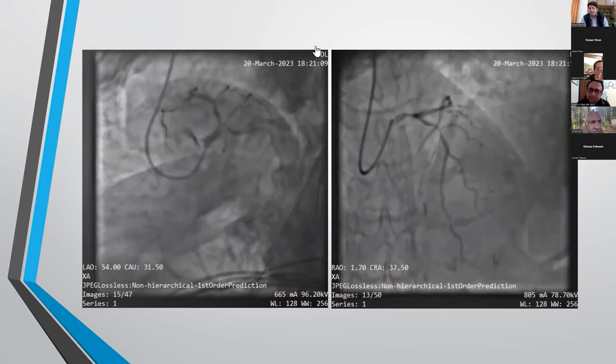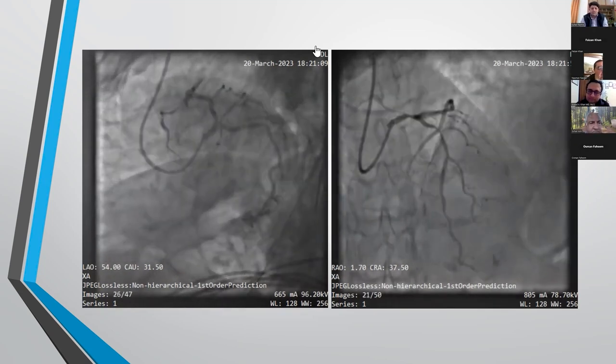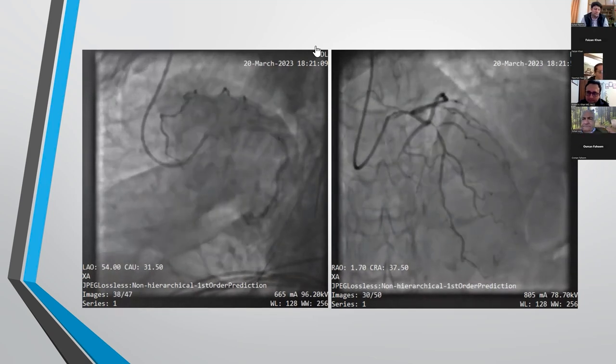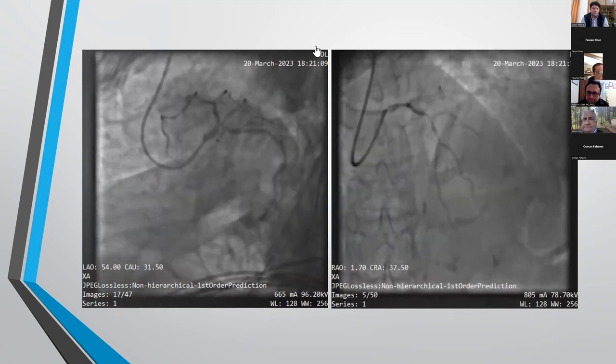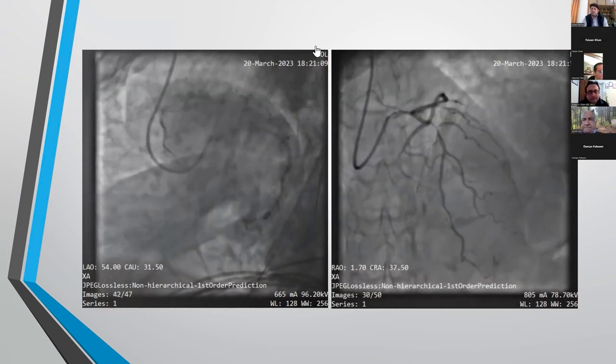The advantage was seen actually more with the LAD and circ, that if you got a bigger area, then you had better outcomes. I don't know if you're targeting those areas, Asad, Bashir. A paper in the JACC came out regarding that.